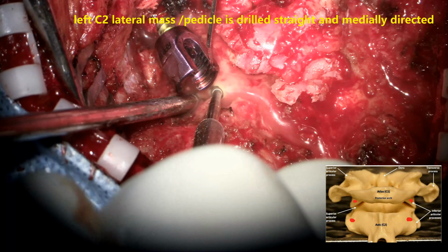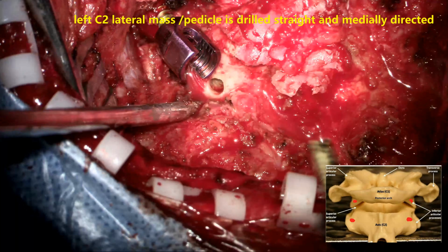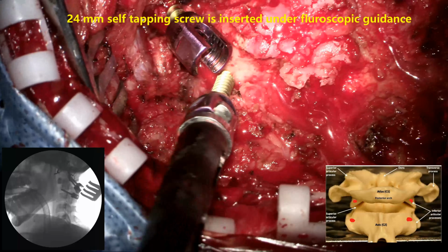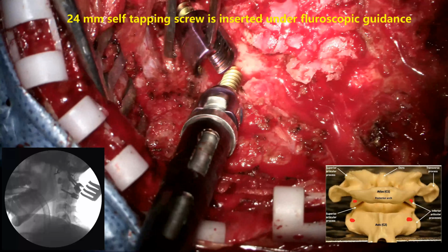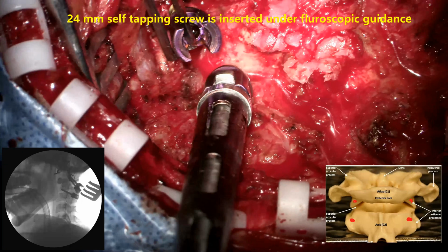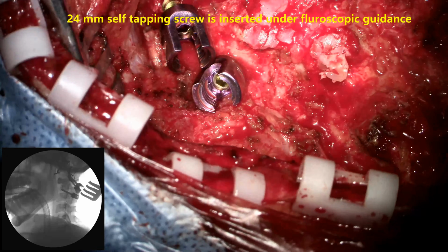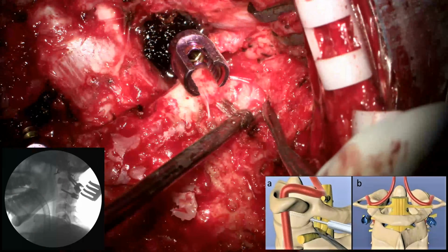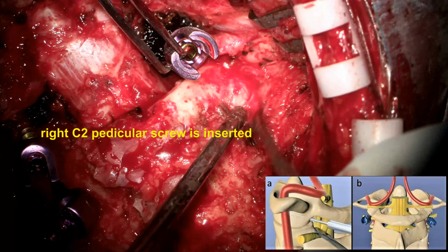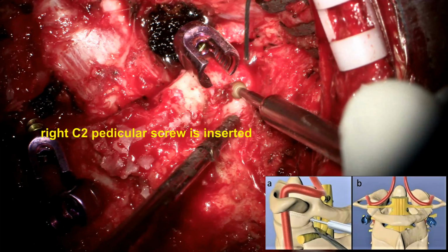Now coming down to C2, we put a pedicle screw in the C2. The central part of the lateral mass is selected, and the drilling is done anteriorly and slightly medially, about 10 degrees, entering the body of the C2 vertebra, again under fluoroscopic control. And a 24 millimeter, 2.4 centimeter screw is selected and inserted.